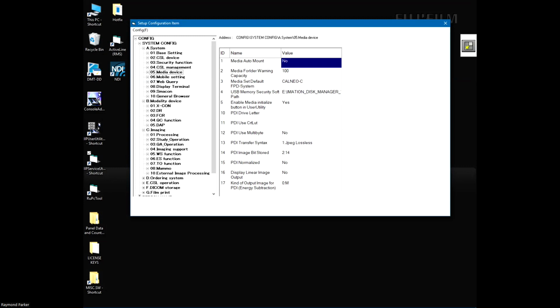In that situation, the site should have some avenue to take the images from the FDX console and put them to an encrypted USB stick. When I have this conversation with my customers, I try to encourage them to work with IT to develop a HIPAA-compliant process to upload images to that thumb drive if there was an emergency where wireless connection or direct connection becomes unavailable for a prolonged period of time.